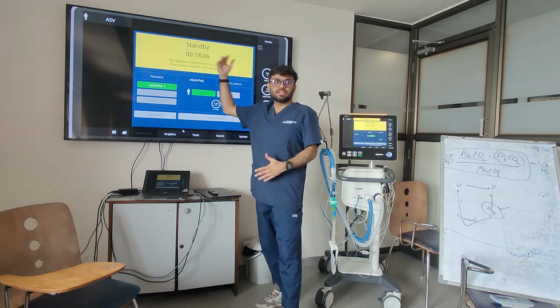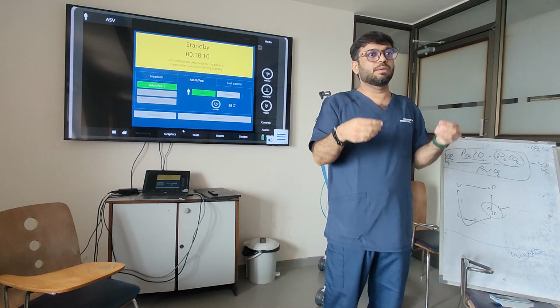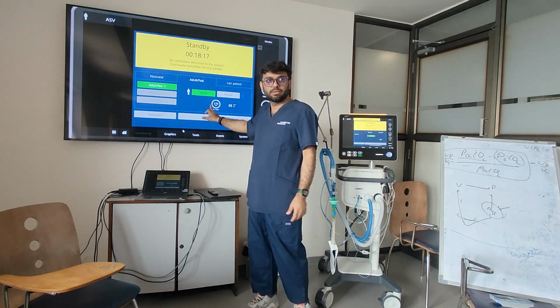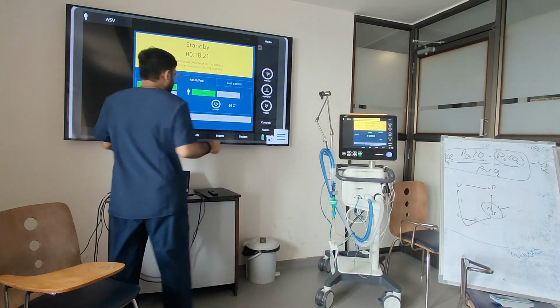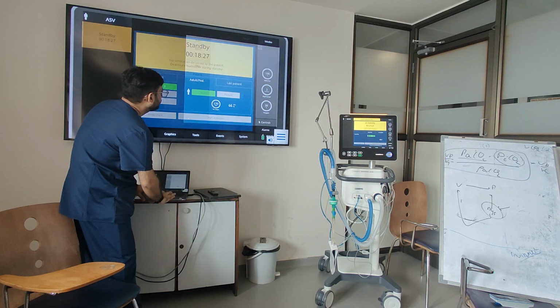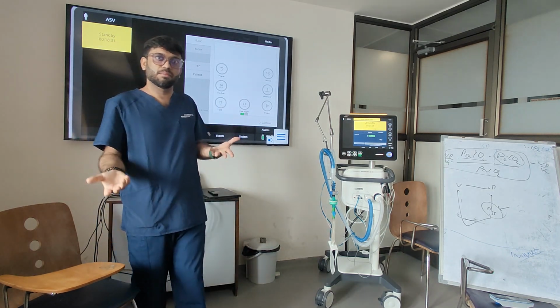Now what I have seen in the slide, I'm going to set the percentage minute volume. And to start the percentage minute volume, I will start with 100%. Why 100%? I will show you the significance here. Now this is 100% set here. My height is 170 centimeter, my ideal body weight is 66. So that means for an adult, as I said, it will take 100 ml per minute per kg. So if I show you here in the controls, the machine has set for me 6.6 liters per minute of the minute volume.